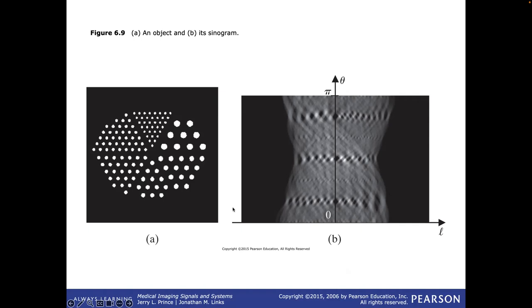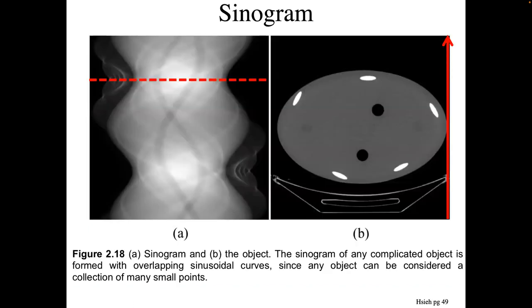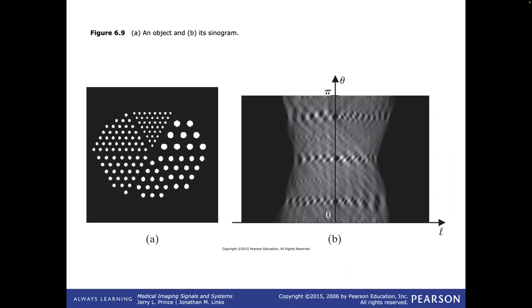You could do this one in your head, because you have very discrete things. You go, oh, it's some kind of ellipse because it's got this wavy thing, and I know inside that ellipse there's a couple of dark things, etc. If you looked at that other sinogram and asked, what's that? It's probably very difficult to do that in your head. You can try, though. You can build up a whole library of things.